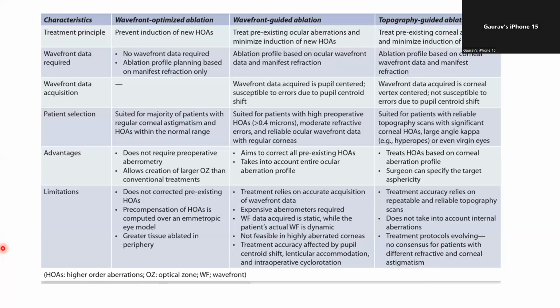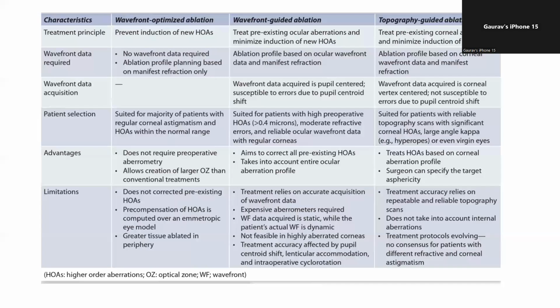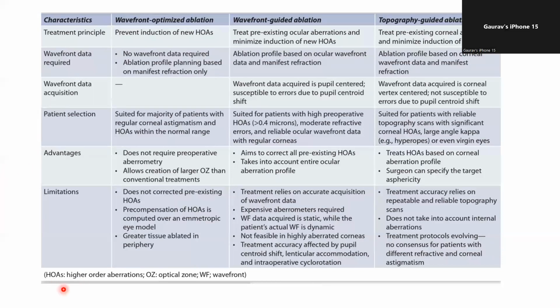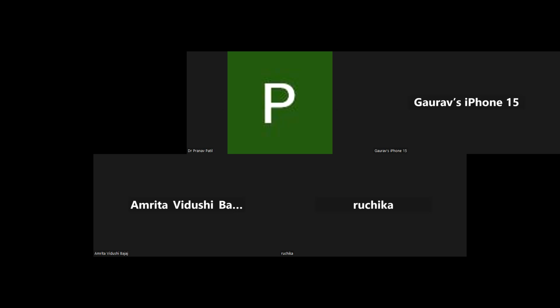You just said that in the mid periphery, we were doing something more, right? Yes, we were ablating. Imagine that you're sitting on a hilltop, the sun is there, and at 12 noon you will get the full force of the sun, a round spot. But as you start going down the sides, that same spot will start becoming oblique instead of round.